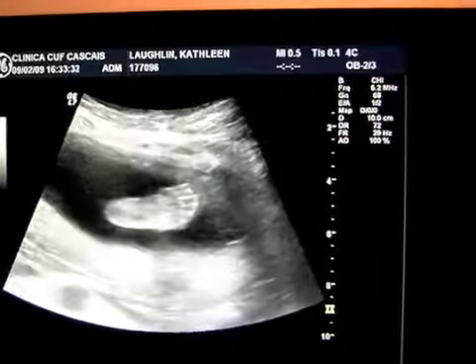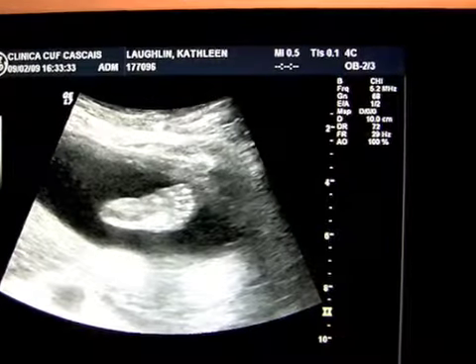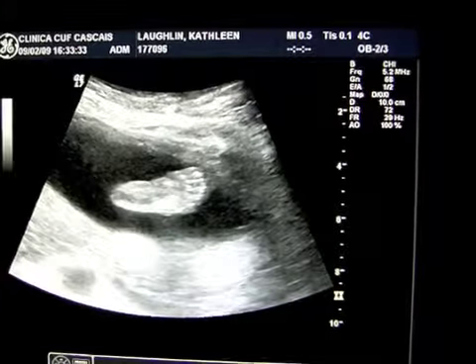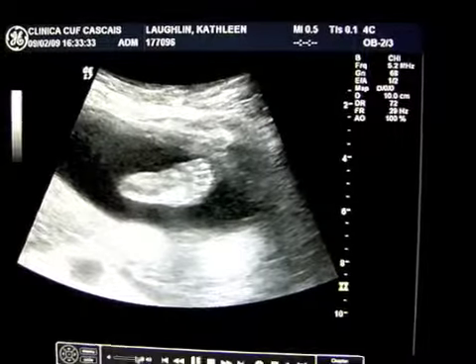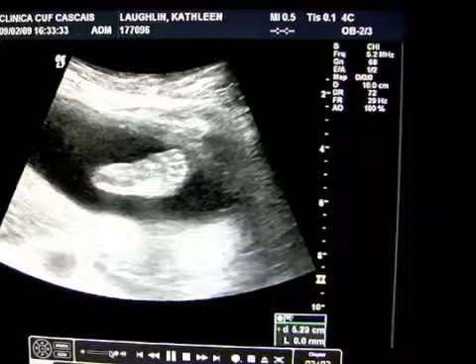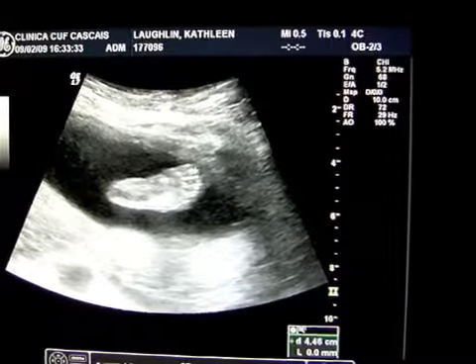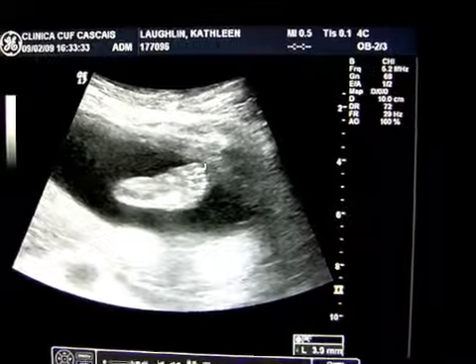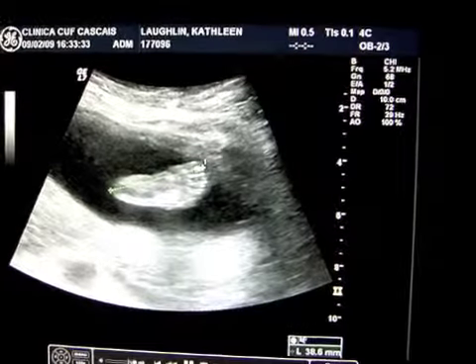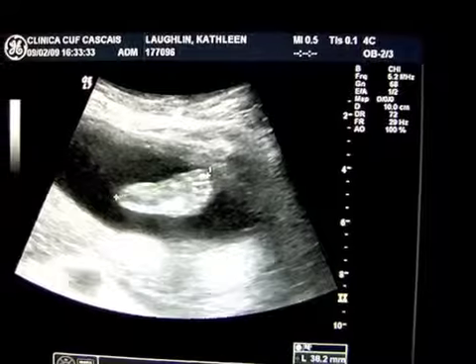There we saw a really cute look at her right foot, and again that was a measurement he needed to get, so he measured her feet, and again he thought that she had a little bit bigger than average feet, 3.8 centimeters. Yeah, 3.8 centimeter foot. So I've got two 4-centimeter feet kicking around inside of me. That ought to feel good pretty soon. So you can see he's getting such a good measurement. Such a cute look. Don't throw away your old shoes. Yeah. We'll need them in 1 year.